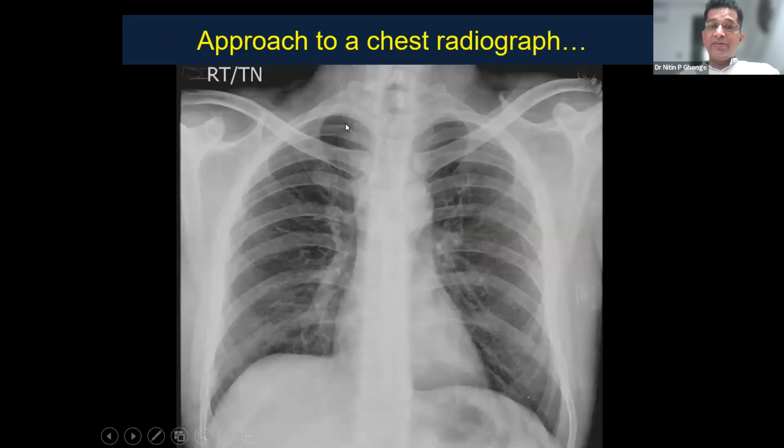right side. Similarly, chest radiograph is very important for nephrologists because of the common complications in CKD, ranging from pulmonary edema to fungal infections and other lesions in the lungs. So it is important for a nephrology resident to at least pick up the abnormality, compare the apex from 2 sides, compare the upper zones, compare the middle zones, compare the lower zones on both sides.